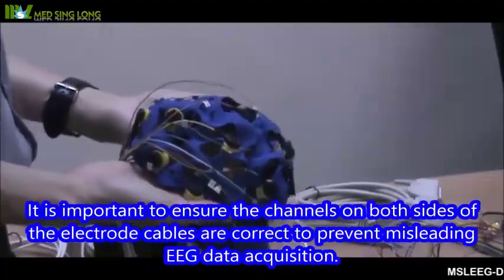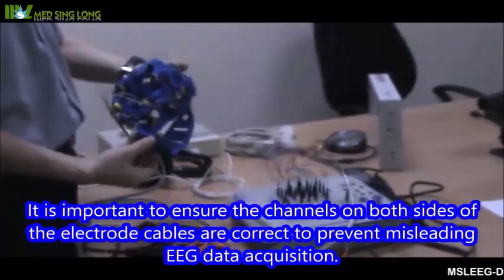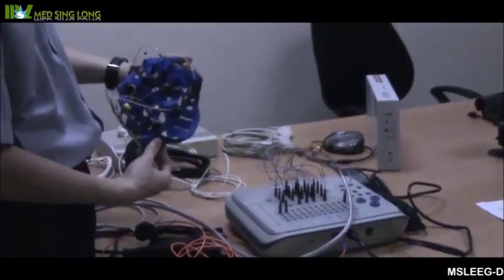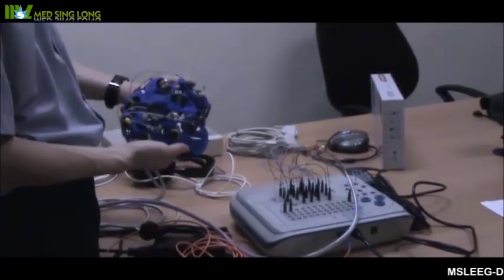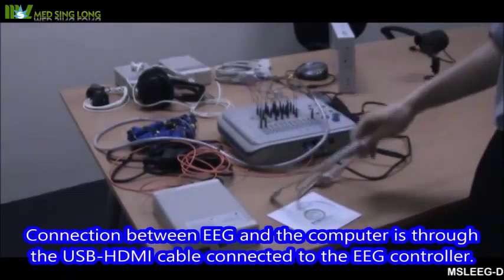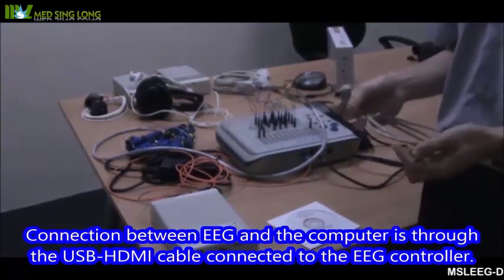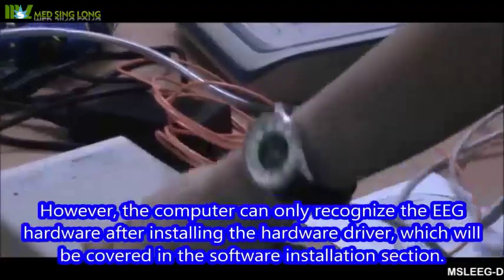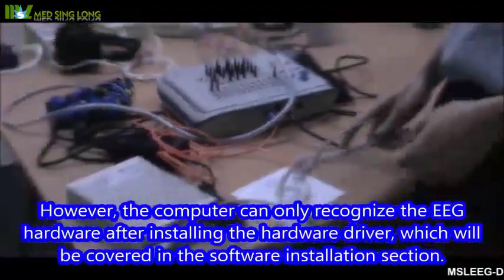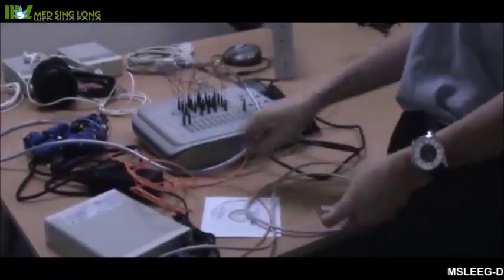It is important to ensure the channels on both sides of the electrode cables are correct to prevent misleading EEG data acquisition. Connection between EEG and the computer is through the USB HDMI cable connected to the EEG controller. The computer can only recognize the EEG hardware after installing the hardware driver, which will be covered in the software installation section.